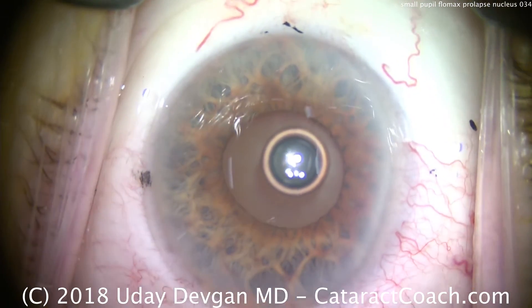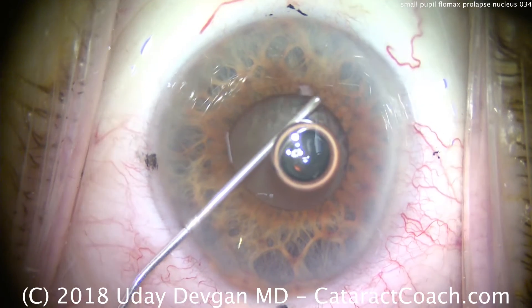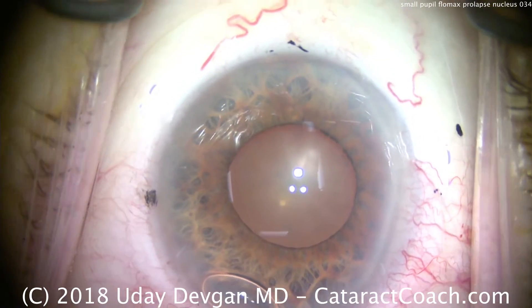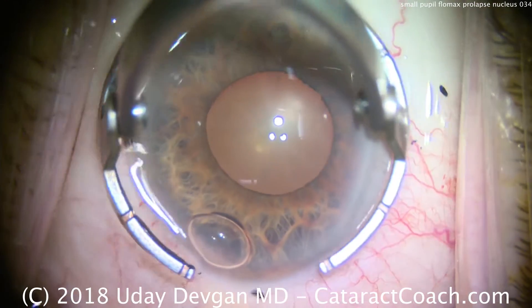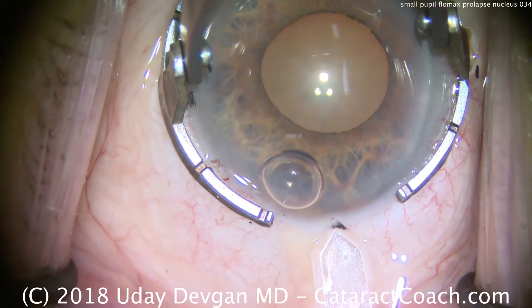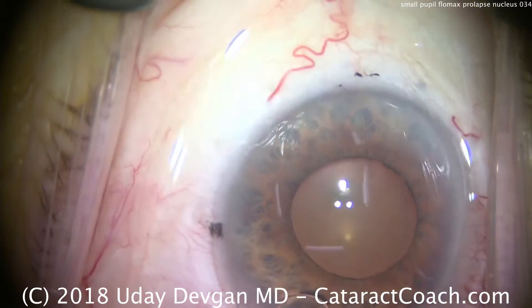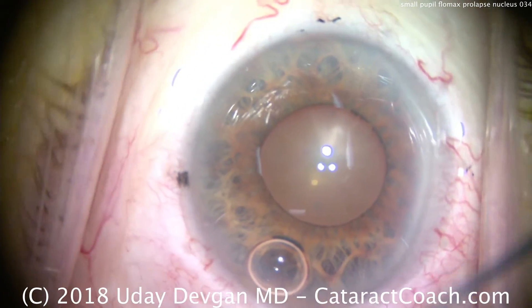We just put some anesthetic in the eye — some preservative-free lidocaine. Still doesn't dilate the pupil. We'll now try to do some viscomydriasis with a dispersive viscoelastic, and not much help either. We'll make our main incision. We're going to have to do some pupil stretching here to get a sufficiently large pupil. Could you put in a pupil expansion device — a ring, some iris hooks? You could certainly do that as well; that'd be a very reasonable option. But in this case, can we do the surgery without resorting to those devices?